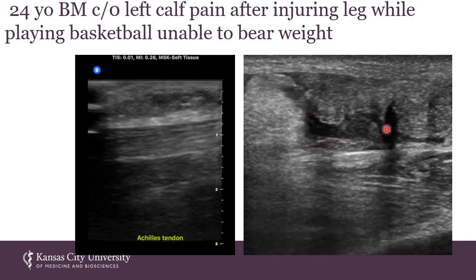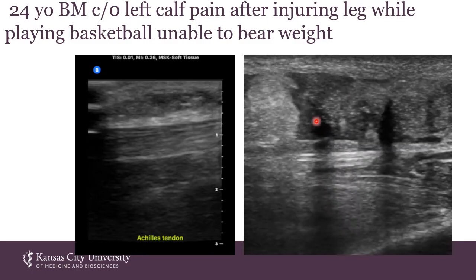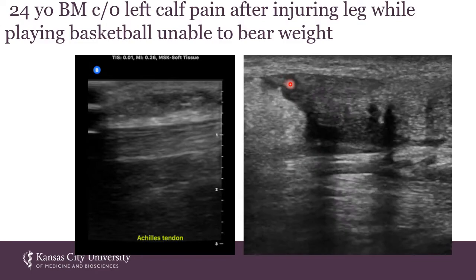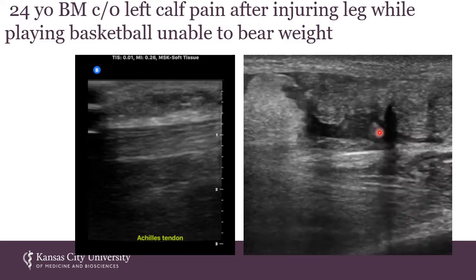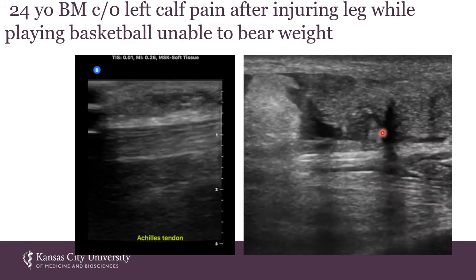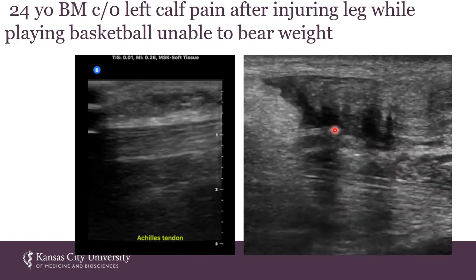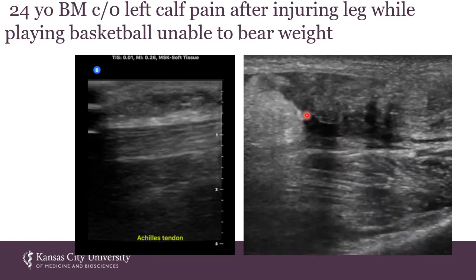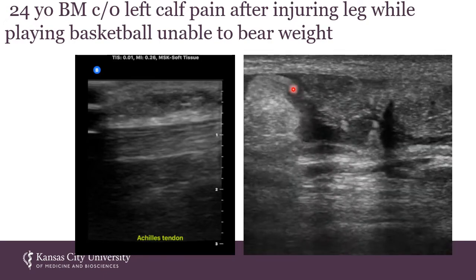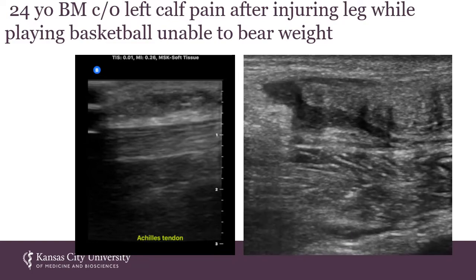So I was able to basically take this with my little pocket handheld unit and send that to the orthopedic surgeon that was going to see him, and he went ahead and scheduled surgery and did the operation on him without the patient ever having had an MRI or any of the usual diagnostic testing that was needed. Now, all this dark here is blood. And there's a little kind of some floaties around in here. It's probably coagulated blood, but right there you can see the clear disruption of the Achilles tendon. So here's a ruptured Achilles diagnosed with point-of-care ultrasound.